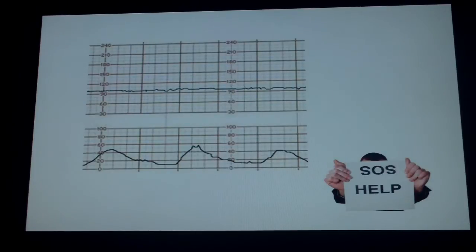And also keep in mind, if you have something that is so low like that, or anything, it's just good practice once in a while to apply your pulse ox to confirm. And if anyone looked at it after you, if you had something happen, they could see your line of thinking that, yes, I just need to confirm that I'm always monitoring the baby. I don't have the mom on for some of these times. And the bradycardic ones especially are important, and I think you guys already know that.